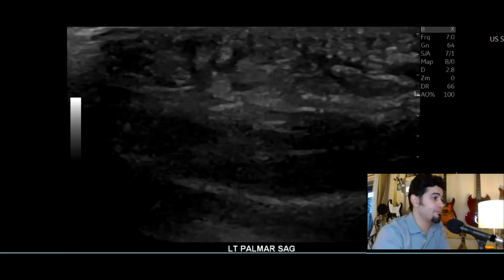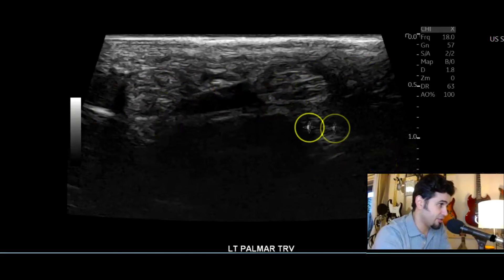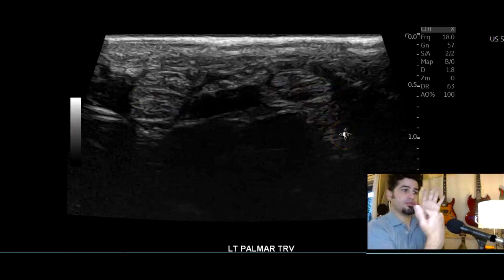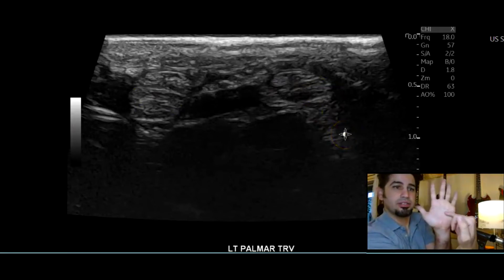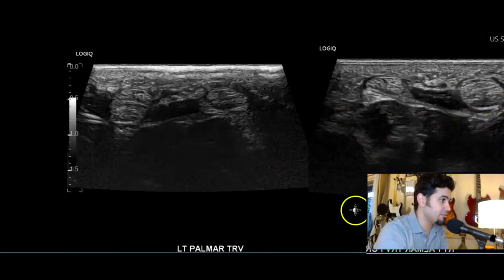In the transverse view, you can see the two flexor tendons — the fourth and fifth. Then bilateral imaging showing the comparison: flexor tendons are intact on both sides. Naturally they would be intact on the other side since there's no injury there.